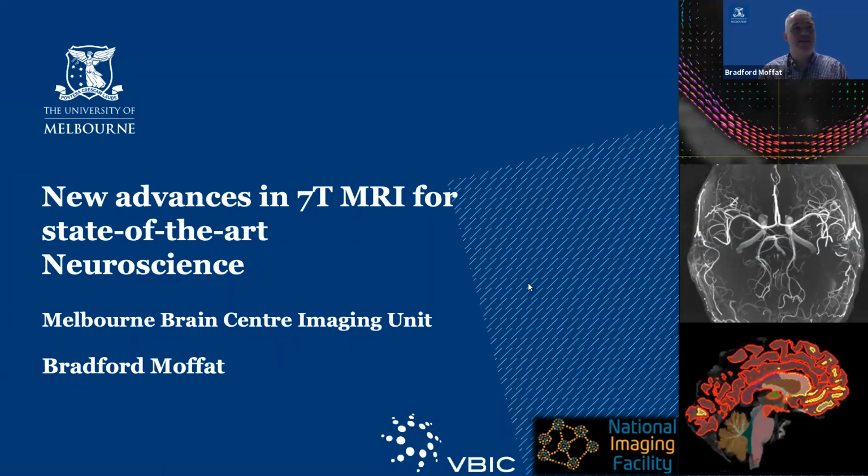Yes, as Gleb said, the title of my talk today is on the advances of ultra-high field MRI for doing neuroscience. And in terms of human imaging, when we talk about ultra-high field, we're really talking about 7 Tesla MRI and above.